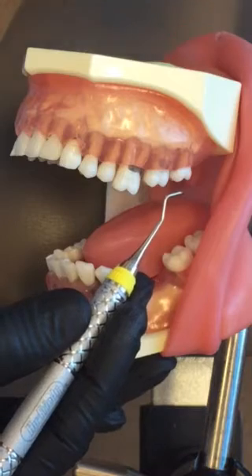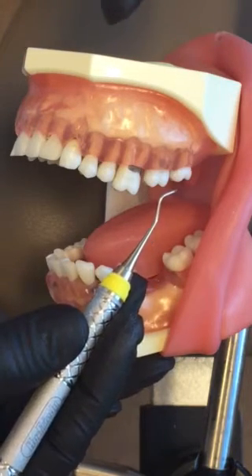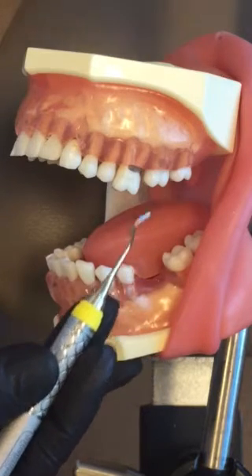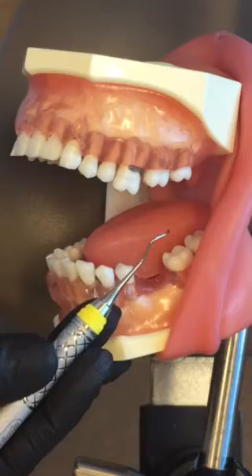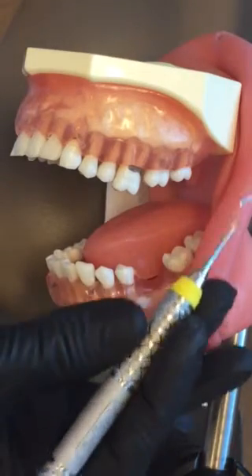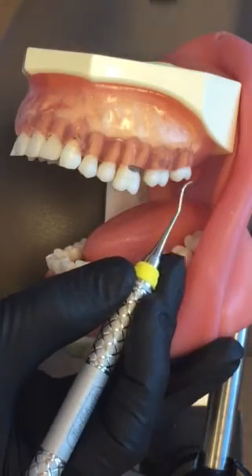First, what you need to do: you've got your patient in maxillary positioning. I'm going to be sitting at 10 to 11 o'clock for a right-handed clinician, for the surface away from me. Then I'm going to establish the correct working end — what I'm looking for is which end is going to be parallel when I establish my fulcrum.